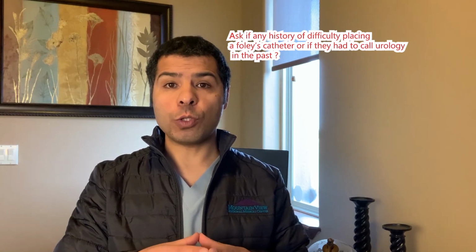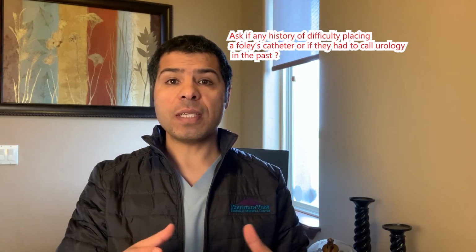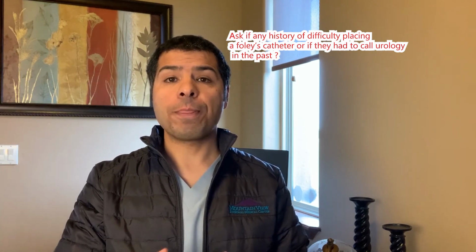Also, ask the patient. Unfortunately, this may not be that realistic because in the US, these Foley catheters are mainly placed by nurses. But nurses and us, we should ask the patient if he or she ever had a Foley catheter before, and if it was difficult to place, or if they had to call urology for that procedure, or if the patient had a recent urological procedure or has a history of urethral strictures. In these cases, we should save ourselves all that time and call urology.